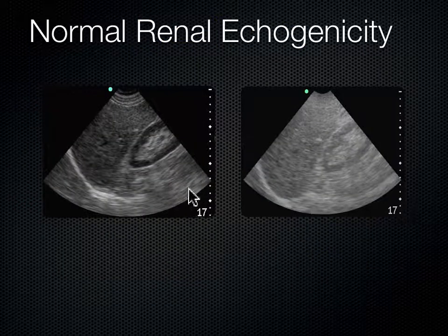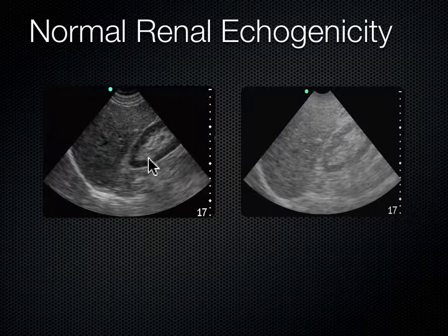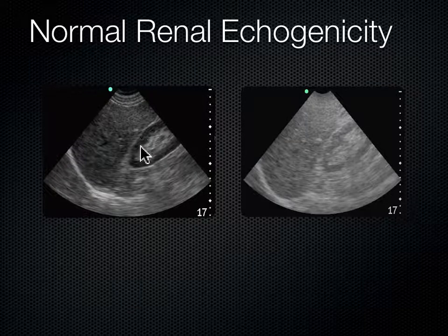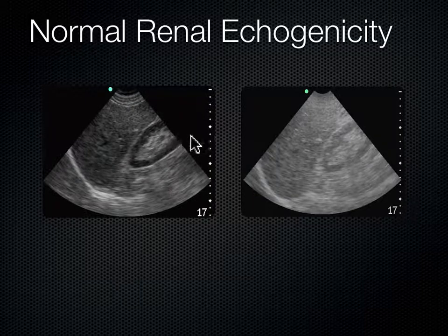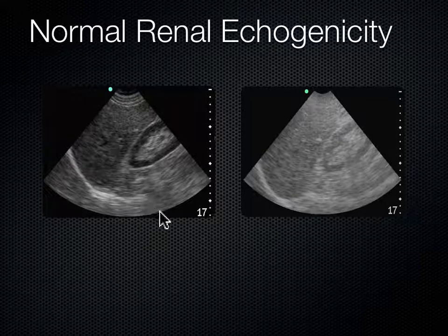Looking at these two images, both range down to 17 centimeters depth, but the difference is gain. The right image is over-gained — pretty washed out. The left image shows the cortex of the kidney as slightly darker than the liver, which is correct. If you can make out those subtleties, you've got your gain adjusted just right. Over-gaining washes things out and makes it hard to tell that the cortex is less echogenic than the liver. I know my gain is set right when my kidney cortex looks darker than the liver or spleen.